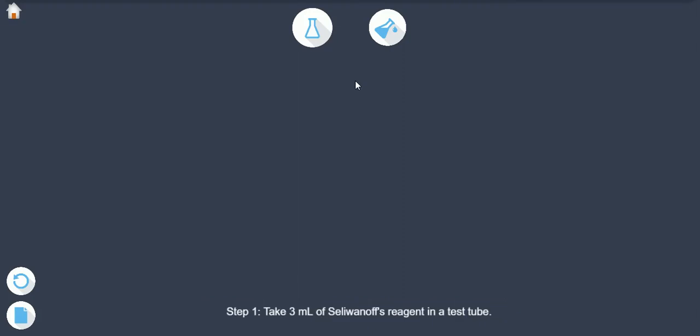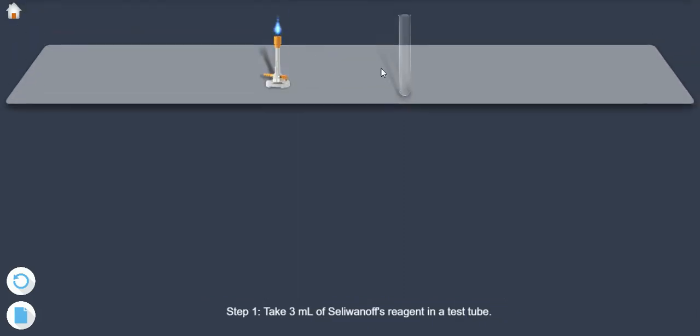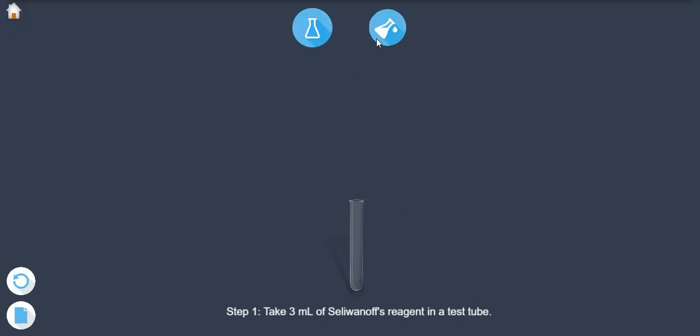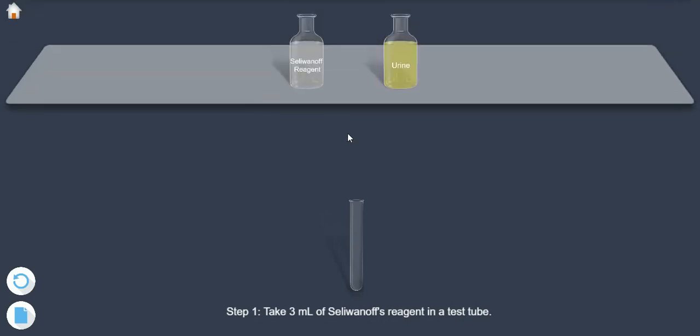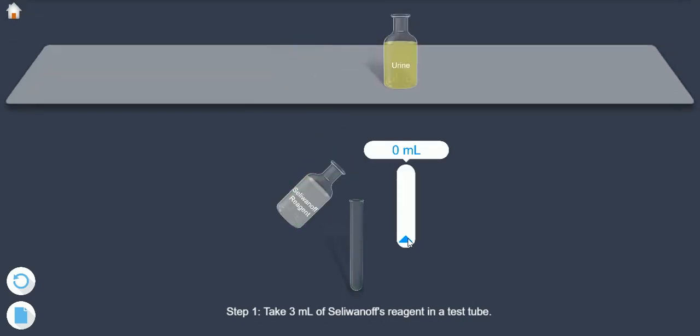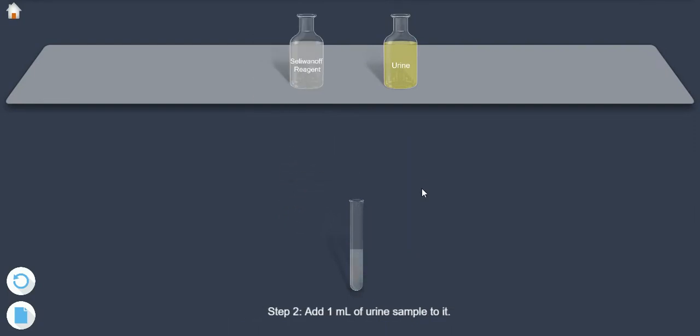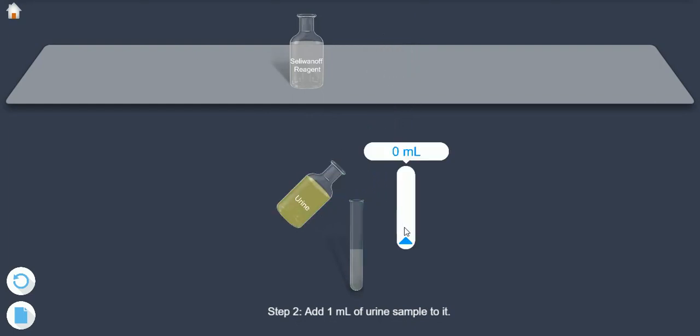Step 1: Take 3 ml of Seliwanoff's reagent in a test tube. Step 2: Add 1 ml of urine sample to it.